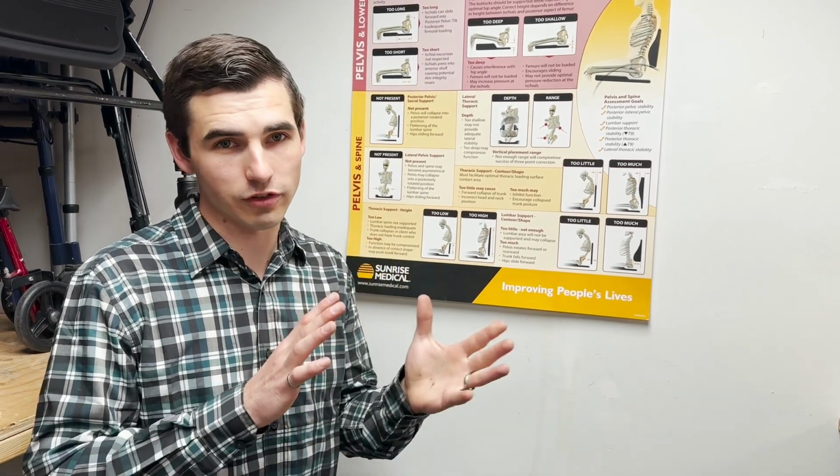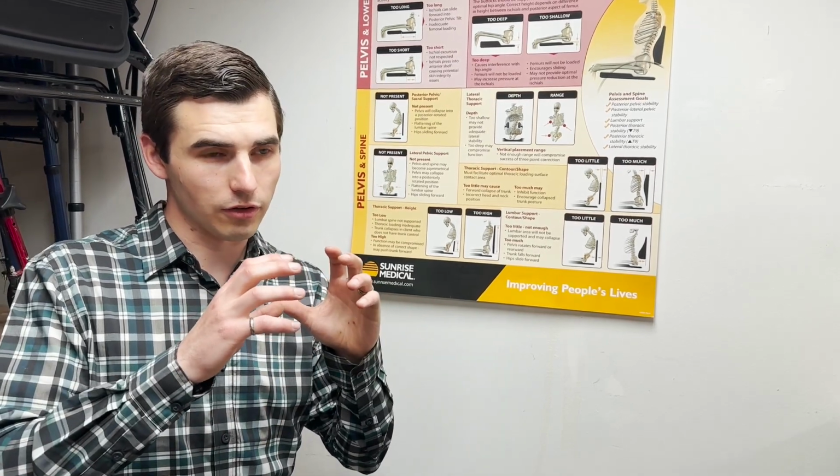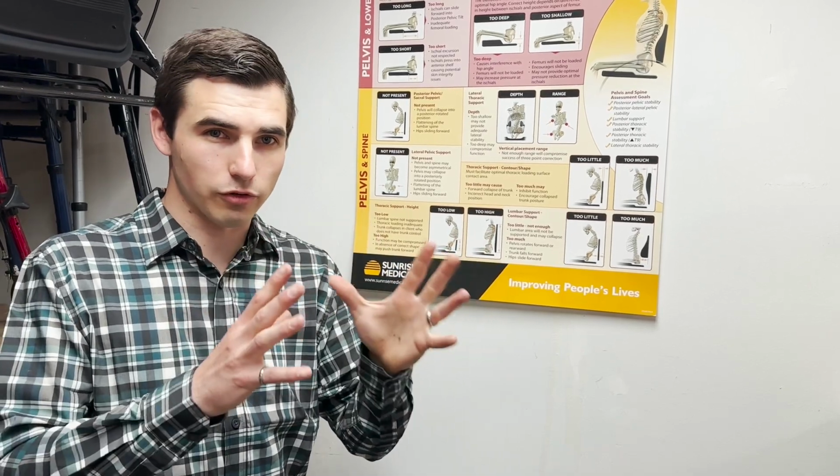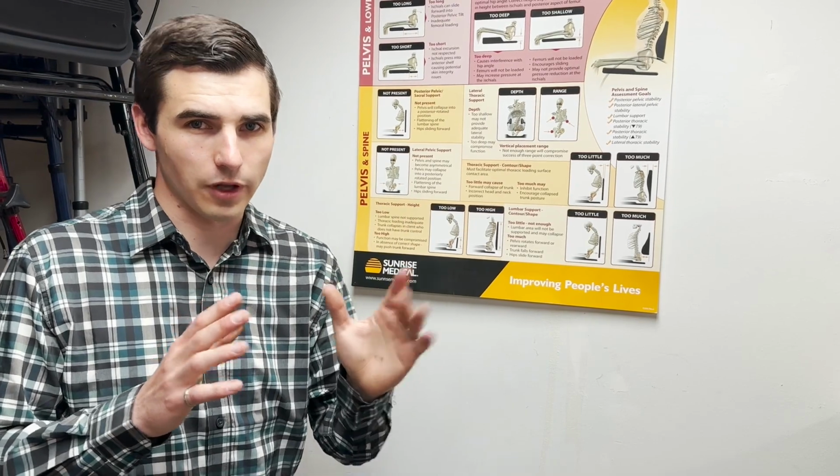And temporary means, could it be temporary? Can we adjust it? Can we modify it? If it's permanent, then we're going to accommodate for it. So think of a custom molded seat back, where the person may have a twist in their back, they sit in the seat, they initiate that chemical reaction that fills the foam around their back and custom molds to their back, right? We're not trying to straighten their back, we're just trying to form the chair to them.